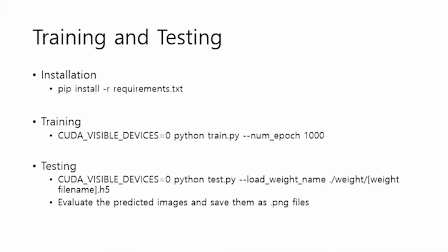The training dataset are not being released. If you want to create a training dataset for network training, please refer to the information in the paper.